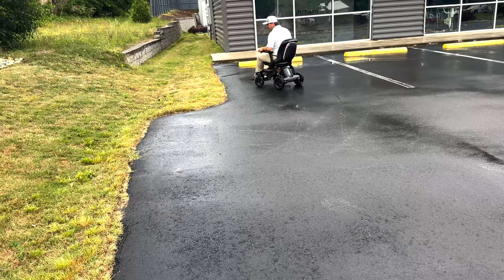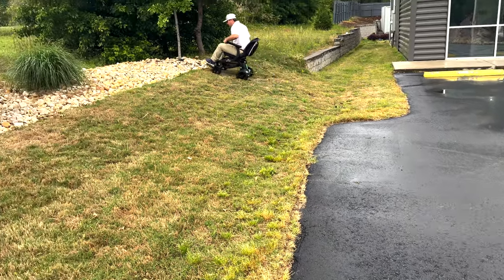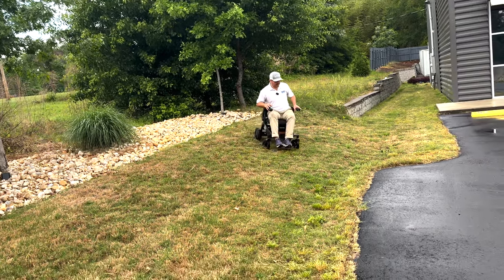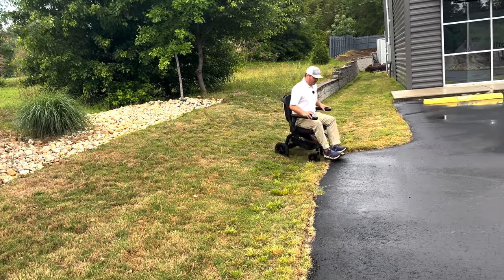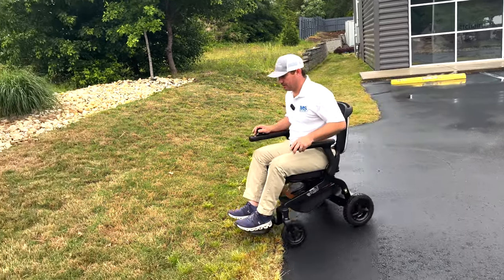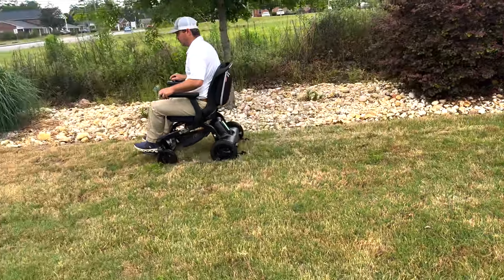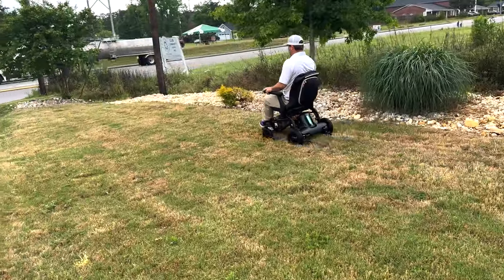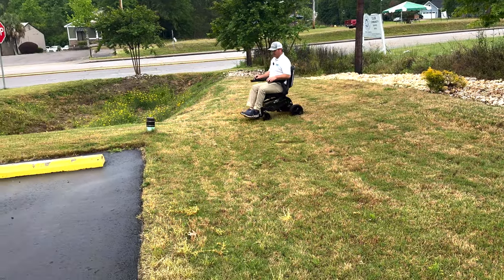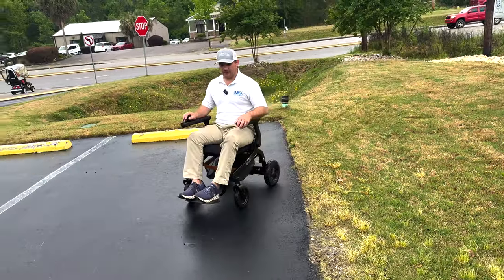Oh yeah. It's a pretty big hill. Leaned forward, made it up it. That's steep, guys. Coming down. Perfect. Let me come over here. And the grass is wet. It passes. This will be fine for outside.